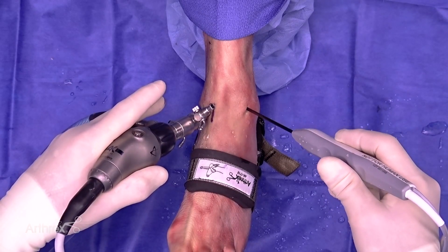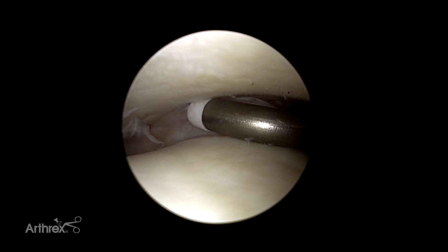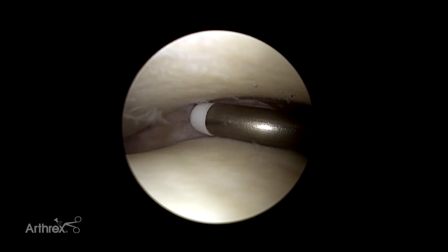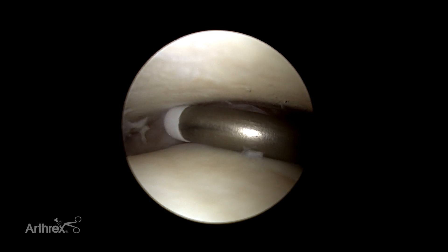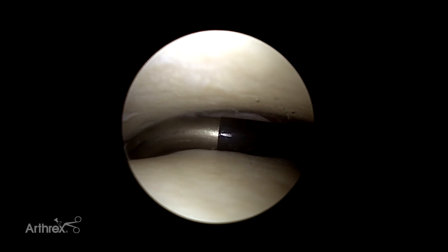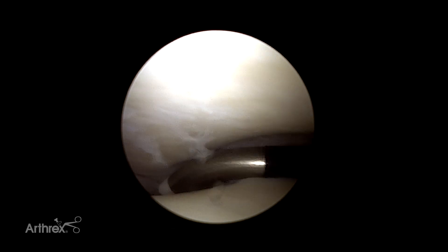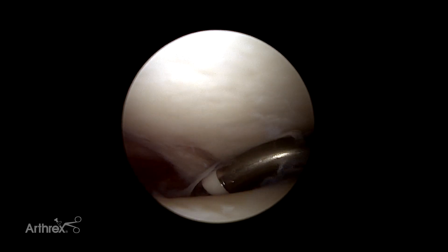Most probes, because they're straight, when they come in that's what you're going to get, so you have to bend your probe with your hand. Most probes are too stiff, so you end up using a pair of pliers to bend it, then you ruin the sheath on the probe and end up throwing them away. This probe has that hook, so you literally can come in and when you rotate, it actually matches the shape of the talus — it is designed to let you go all the way to the back of the ankle.